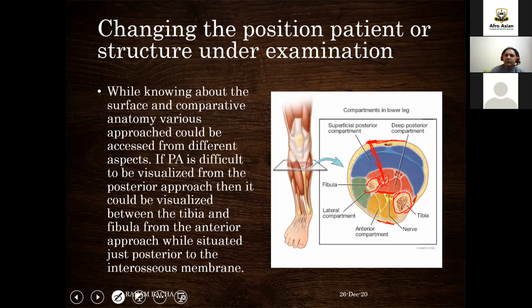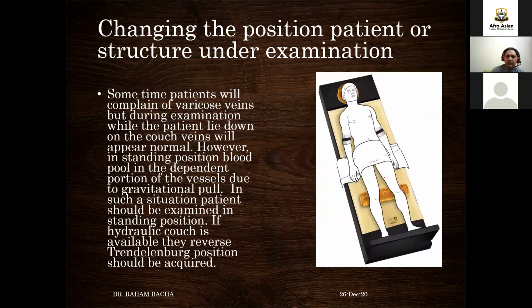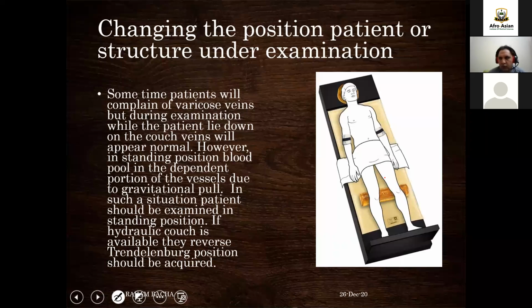You can change the position of the patient as well. Just for example, you have a patient with the complaint of varicose veins, but whenever you start your examination, all the veins are normal and you don't find any varicose vein. That is because the patient experiences these varicose veins in the standing position, when the blood pools to the distal part and the dependent portion of the body.